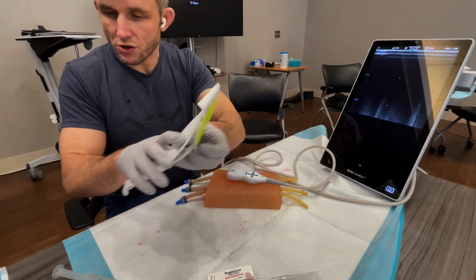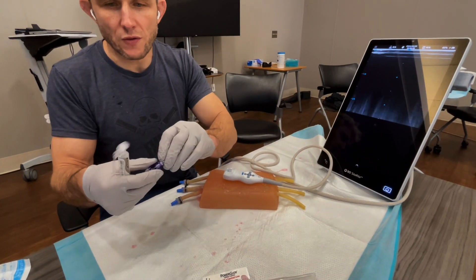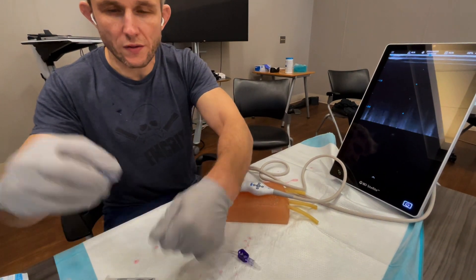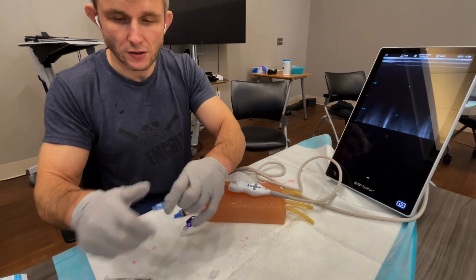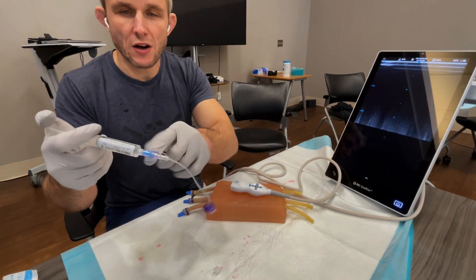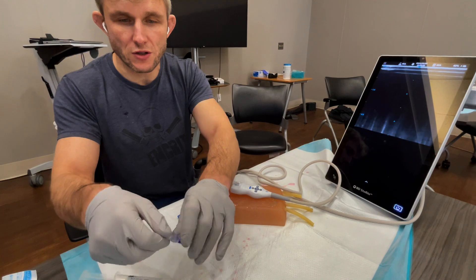What you'll need also, if you want to do this kit, is a J-Loop that you've flushed and a clave to attach to the end of it. Our J-Loops at Hospital Center have the claves already attached, but some of you might not, so just make sure it's flushed and ready to go.